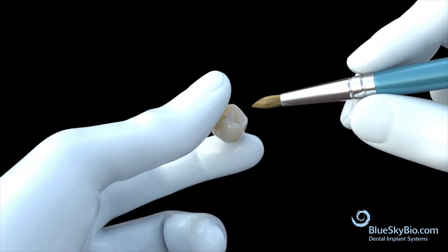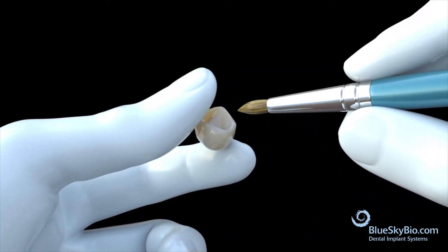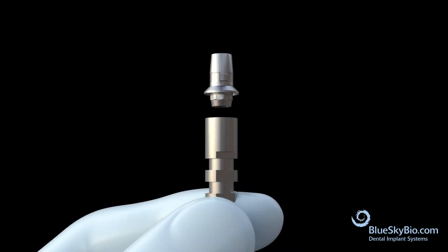Remove the crown and paint it with stain and glaze. Attach the SkyBase digital abutment.